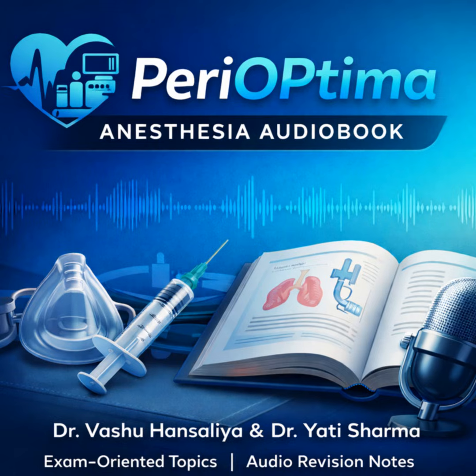Now we're moving to the flow control section where the gases are actually mixed. So if the pressure system fails because of a cross-connection, or if the user simply tries to dial in an unsafe mixture, this next system, the hypoxic guard, is the defense layer against that clinical error. This is the definitive answer segment for that 20-mark question on preventing hypoxic gas delivery. The proportioning system exists for one reason: to guarantee adequate oxygen delivery, regardless of user input. It links right back to that historical realization by Hewitt.